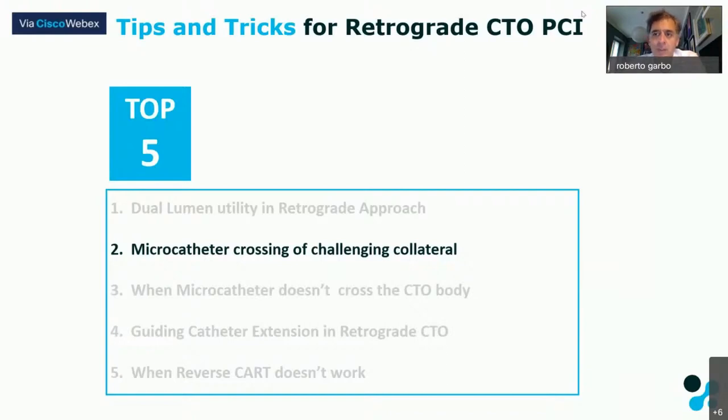So you have to think about that, and preferably I would like not to use it in the epicardial but only in the septal. But in these three cases I had to do that, and I failed in one case. I succeeded in going with the microcatheter in the epicardial in the others. So I think it's a possibility.